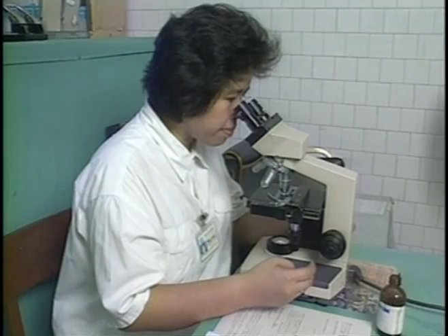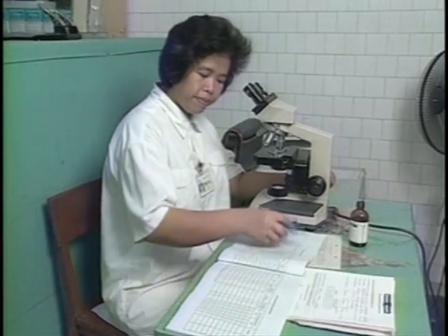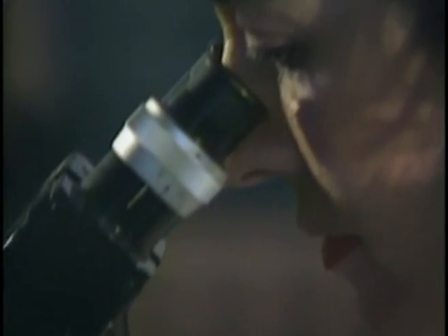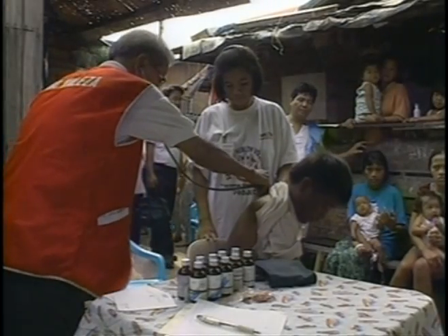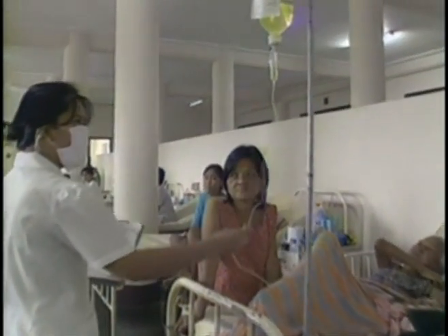This teaching module will focus on the Ziehl-Neelsen diagnostic technique of direct smear microscopy of sputum. Since most TB cases are pulmonary, sputum smear microscopy is the most available tool for TB diagnosis. It is inexpensive, rapid, and simple to perform. More importantly, it can detect the most infectious cases of tuberculosis.